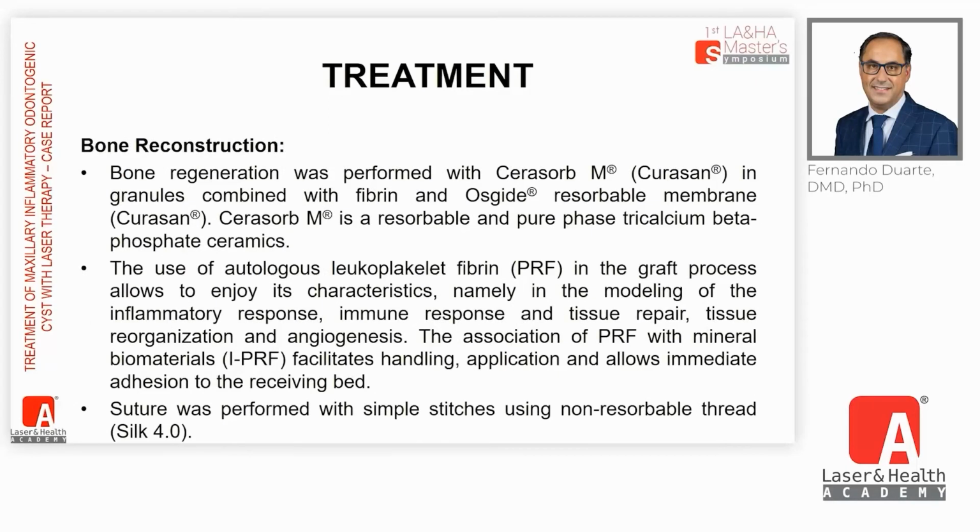In the same surgical time, our goal was to do the bone reconstruction, and for that we used a biomaterial, Ceresorb M, from Curasan, a German company, in granules, combined with fibrin to build what we call the sticky bone, and a resorbable membrane from the same company was also used.